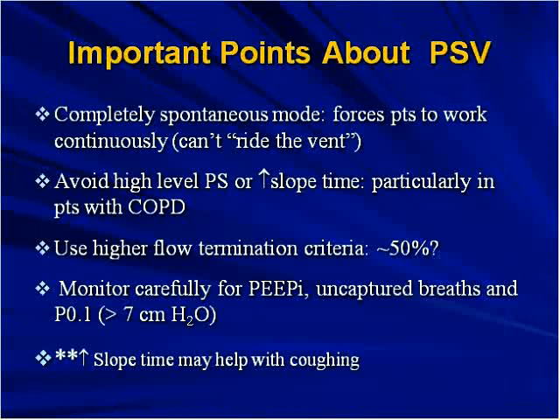I'm actually going to skip through some of these slides and kind of go to a summary here. So complete spontaneous mode, it forces the patients to work continuously. They can't ride the vent. We should avoid high levels of pressure support or high levels of slope time, particularly in patients with COPD. And using a higher flow termination criteria in these patients is probably better, but something you have to figure out at the bedside. And monitor these patients very, very carefully for intrinsic PEEP and uncaptured breaths.